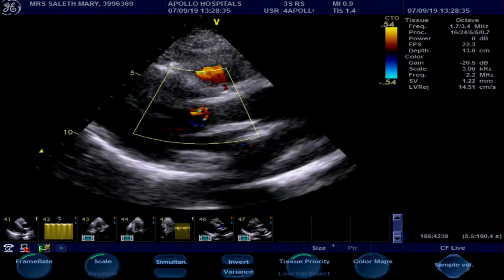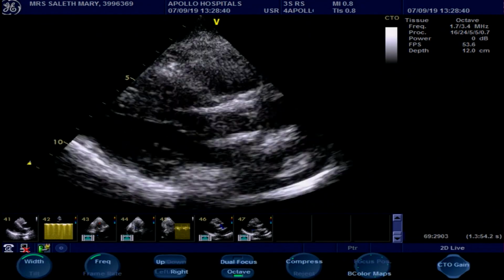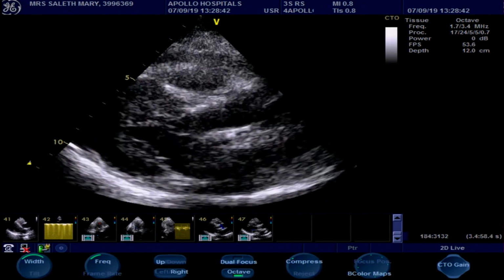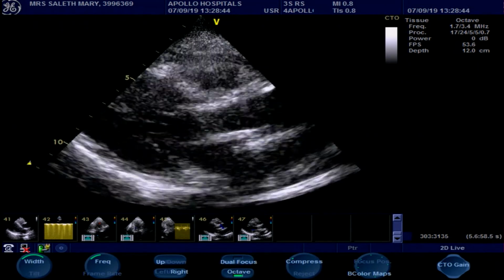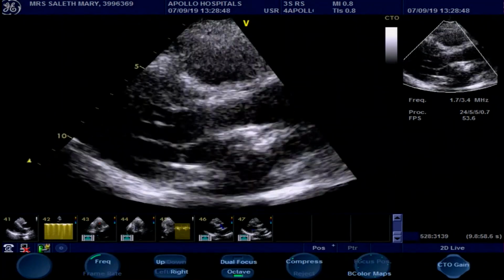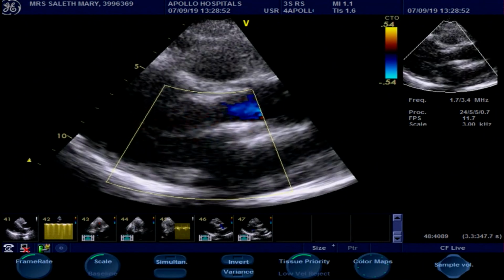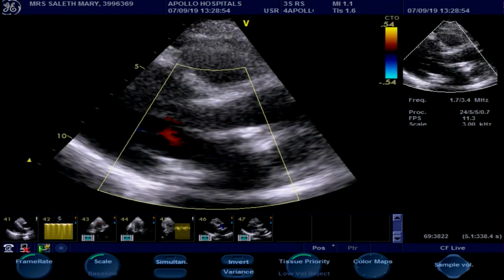Could you comment on the echo finding? You put the stiff wire back. Another view, a short axis, stiff wire, and also a 3 cavity view. So can you hear us in the lab? We've got color, and then can we go to short axis?